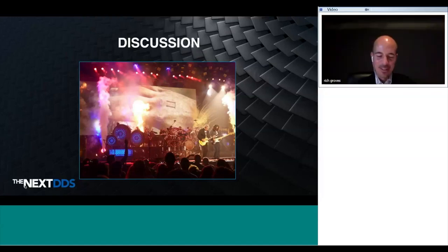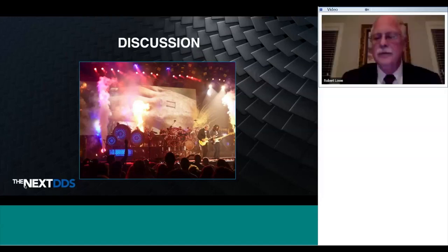Okay. Then one of the questions, we mentioned that your practice has some exposure to CAD/CAM crowns, and I know that you use the term smooth. I'm smoothing my prep to account for the CAD/CAM. Smoothing and polishing preps, right. Do you make any other adjustments to your prep technique for specifically CAD/CAM crowns?